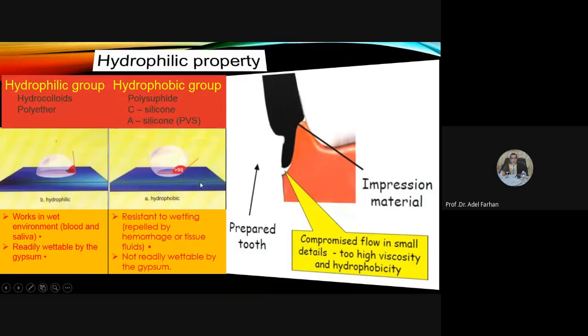مثل ما نشوف بالصورة احنا عندنا لما عندنا solid and solution. If we have a hydrophobic material وهذه hydrophilic ايش عندنا؟ الكونتاكت انجل is less than 90. هنا شنو؟ more than 90. لما نكون more than 90 الكونتاكت انجل عالية معناها surface wettability is less. ولما يكون contact angle less than 90 مثلا 0، wetting ability of the surface عالي. طبعا هذه شو تفيد؟ تفيدنا بالريكورد اوف ذا ديتيل.